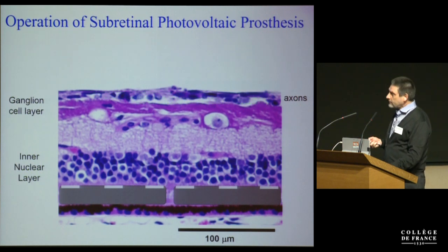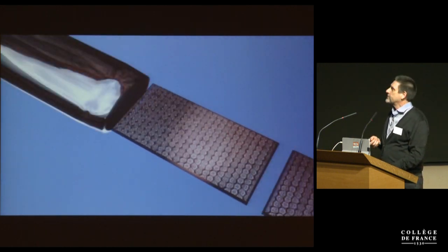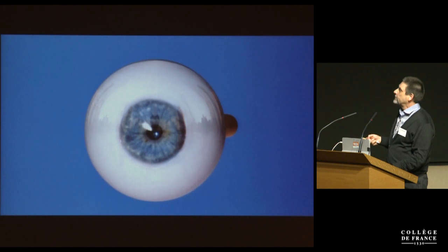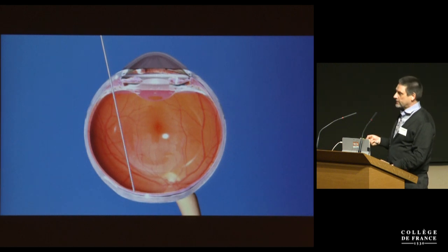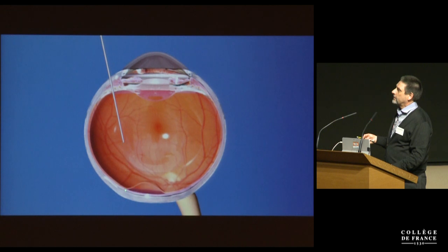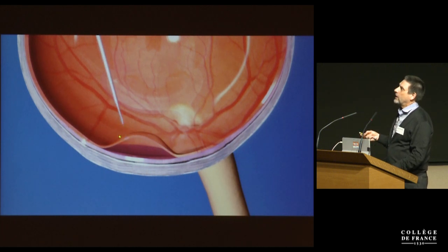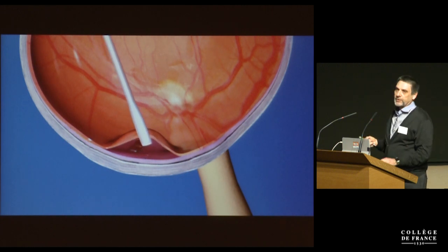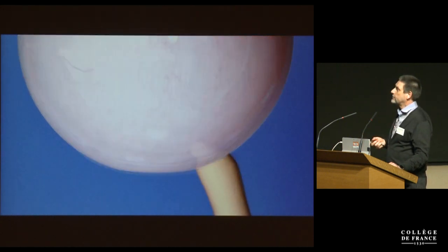Because this system is wireless, we can put these pixels together in small modules and load several modules in an implantation tool and deliver them in subretinal space by injection. So the surgery begins by subretinal injection of fluid, which is a standard step in subretinal surgery. We inject fluid and lift the retina and thereby provide access to subretinal space. We then make a retinotomy of 1 millimeter in width, so it's a 20 gauge instrument. And then we deploy these modules in subretinal space and tile them to cover a larger visual field. So even though we operate through a small retinotomy, we can cover a large visual field. Then the retina is reattached and the surgery is over.